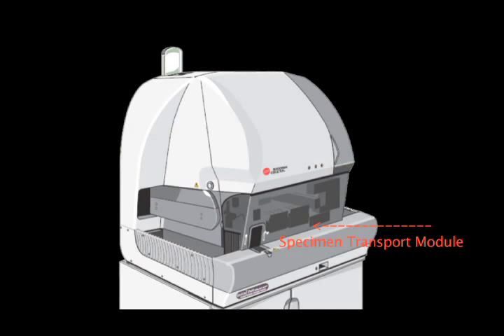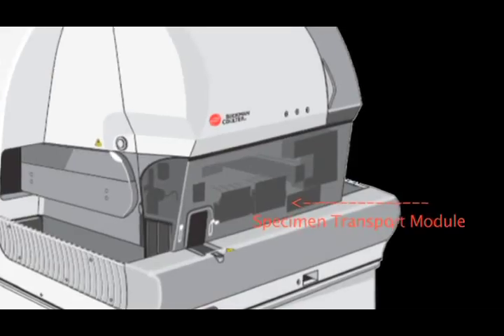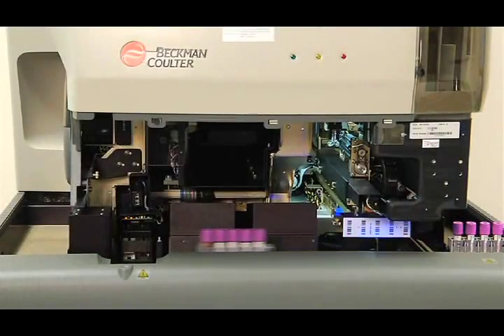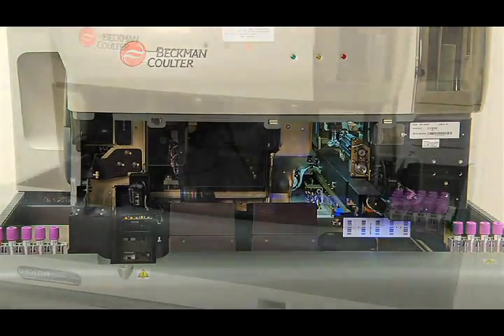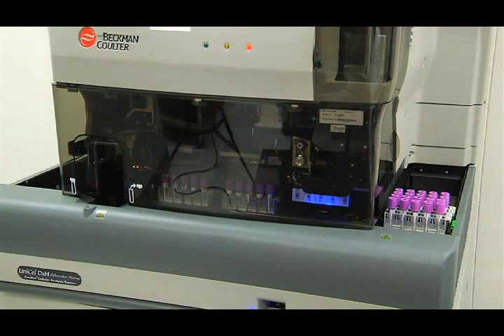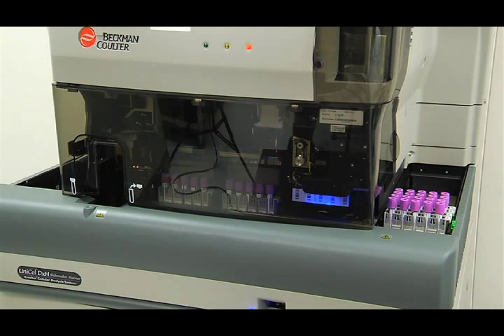The specimen transport module uses a magnetic force to move the cassettes from one location to another. Since there are no exposed moving parts, maximum operator safety is ensured.